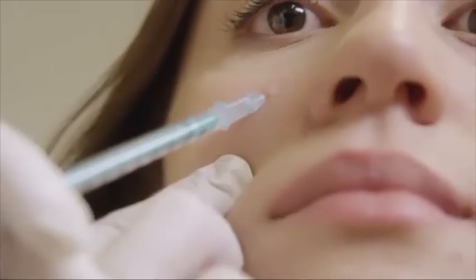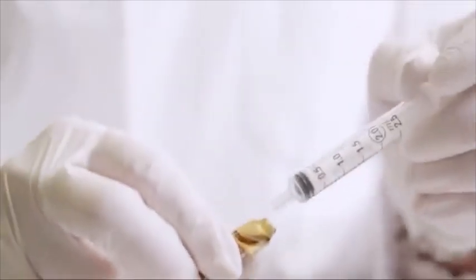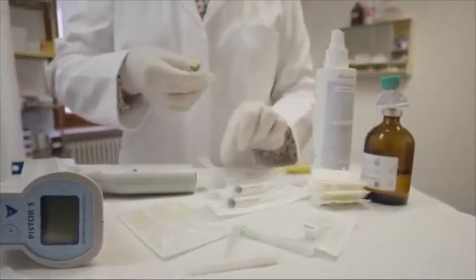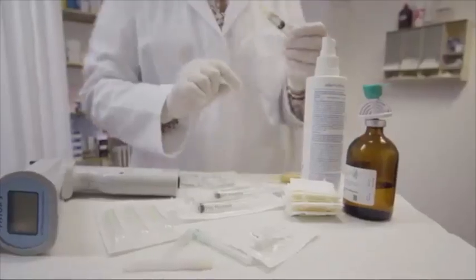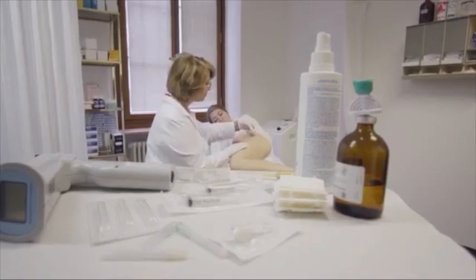The small needles inject various active ingredients into different layers of the skin. Mesotherapy works on acute and chronic illness, as well as in aesthetic medicine. The French physician Dr. Michel Pistor founded the mesotherapy technique. For more than 50 years, the method has been used in France and many other countries successfully. Pistor recognized the most important advantage in mesotherapy. Small doses of medication safeguard the patient's organism. It's also effective in the treatment of painful scars following surgery years ago.